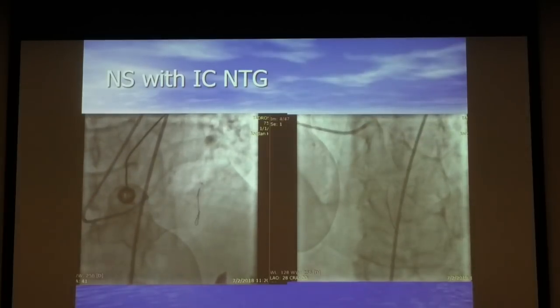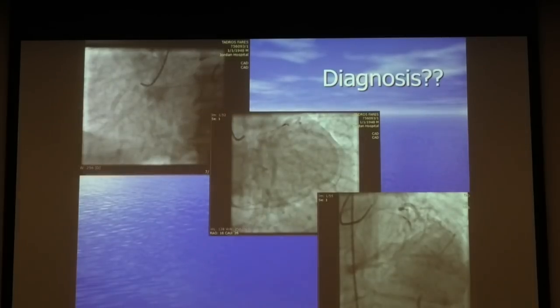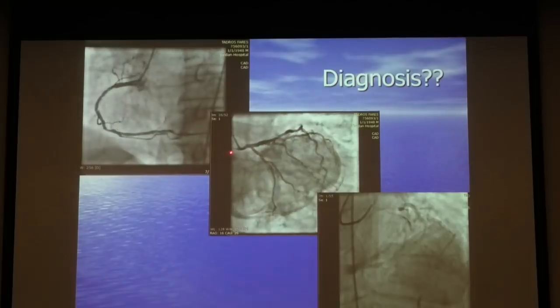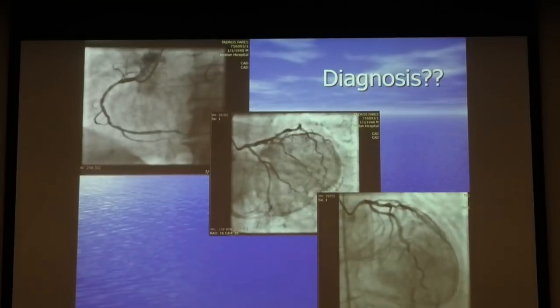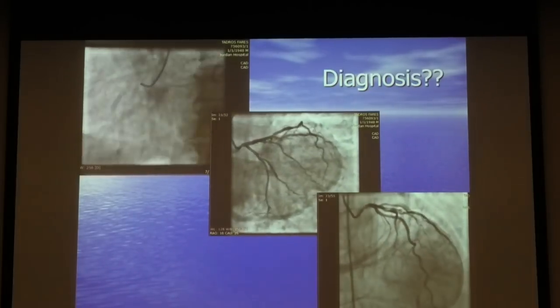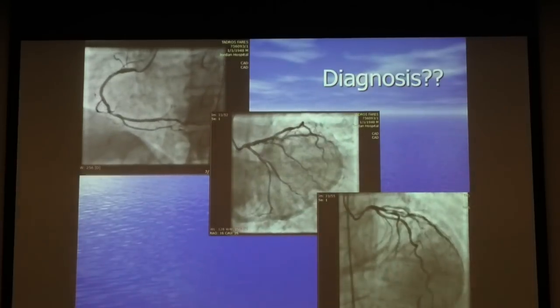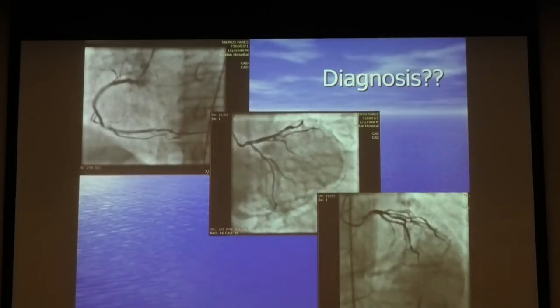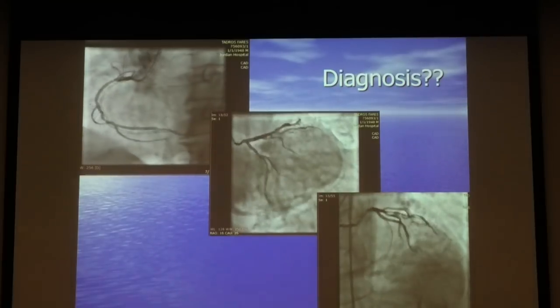What is the best stent strategy here? We didn't see the ostial left main clearly, or the ostium of the LAD. Okay. I don't think the LAD is normal. There's some disease, heavily calcified, angulated, and the left main is very, very short. So there's no way you can confine your stent to the left main alone. You have to really go into one of the major branches. And the circumflex looks good here. So I think provisional stenting using the LAD as the main branch is the proper way to go.